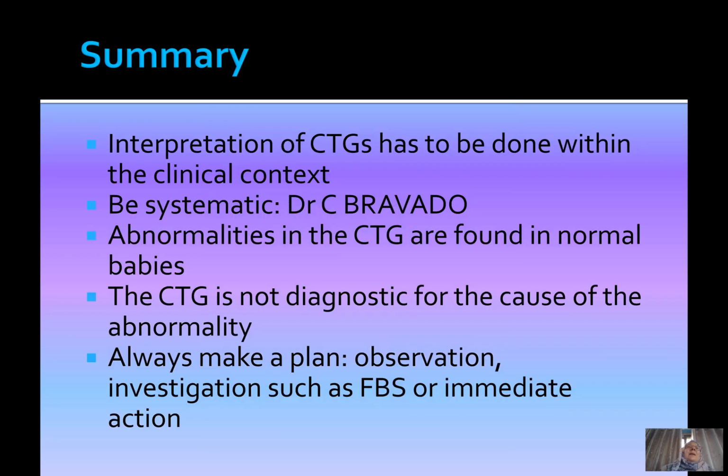So in summary, interpretation of CTGs has to be done within the clinical context. It has to be systematic, so you have to use Dr C Bravado. Abnormalities in the CTGs are found in many normal babies. The CTG is not diagnostic of the cause of the abnormality. And always make a plan.